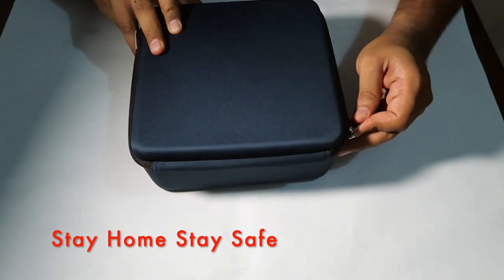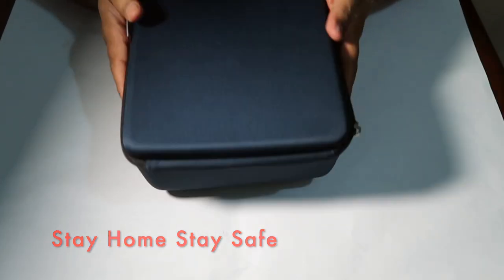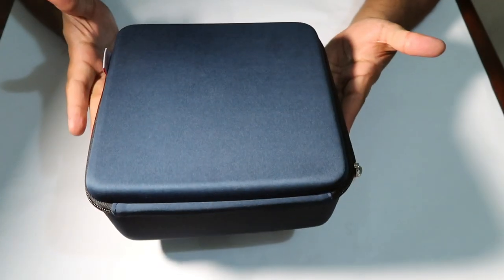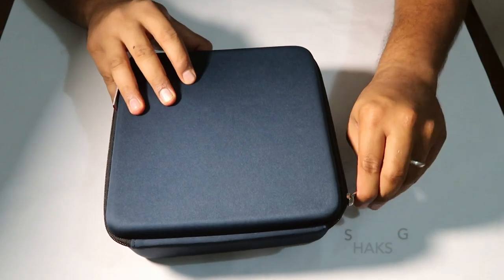I just opened it. It's a small box and a lightweight device. Let's open it.